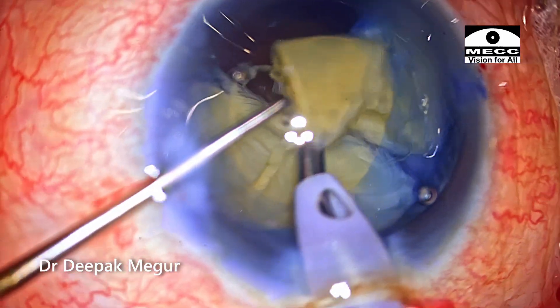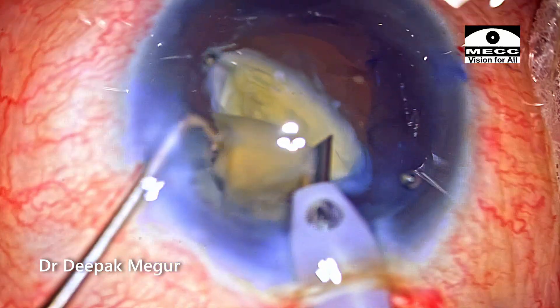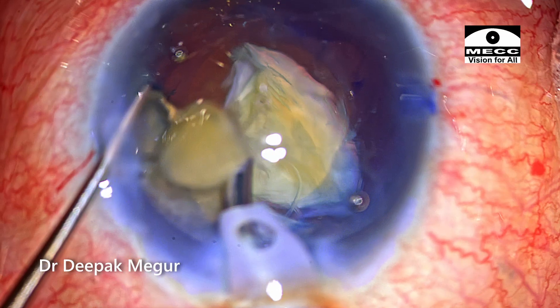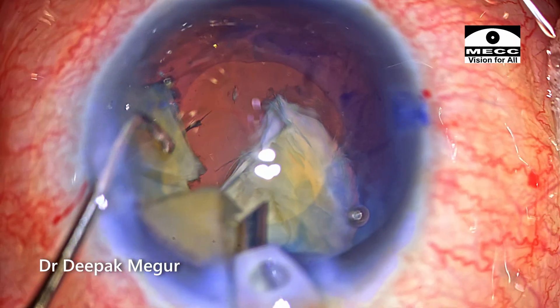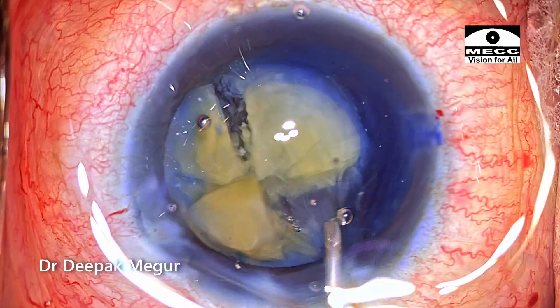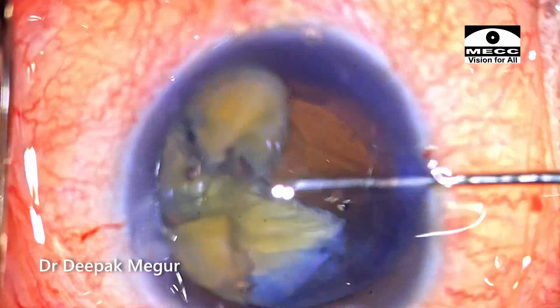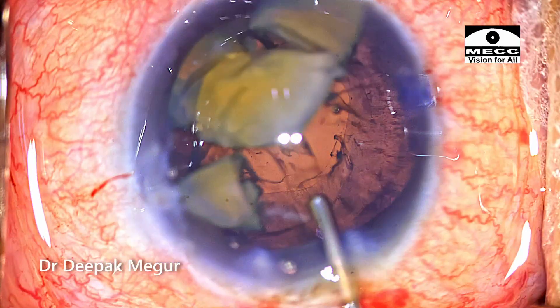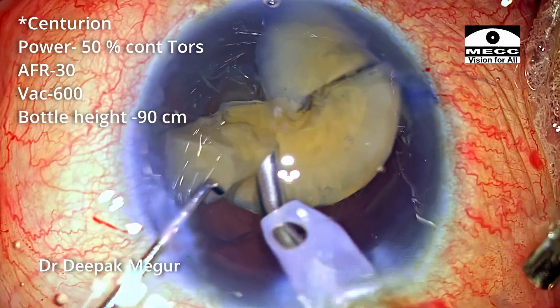I thought these fragments are reasonably sized to begin emulsifying, but some fragments are still attached to each other and as I begin to emulsify, the fragment movement looks very suspicious — it doesn't look natural, so I'm worried there may be an underlying posterior capsular tear. I stop my emulsification and come out. I inject dispersive OVD under the fragments into the capsular bag and push them aside to get better visibility to rule out any posterior capsular tear. After closely observing, I'm certain there is no evidence of any posterior capsular tear, so I go back to emulsifying.